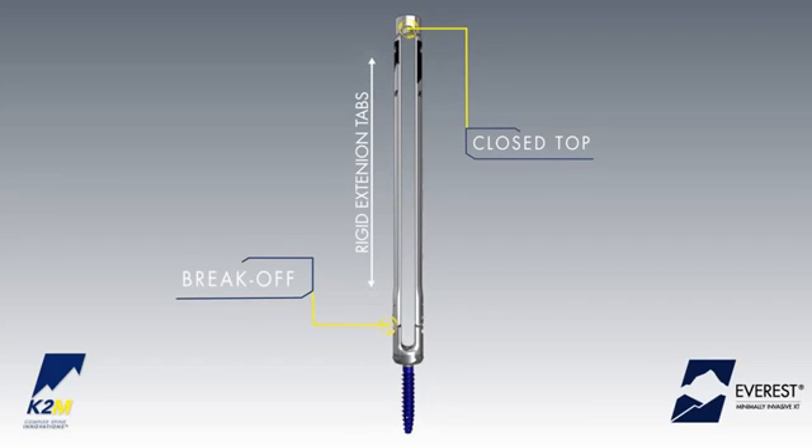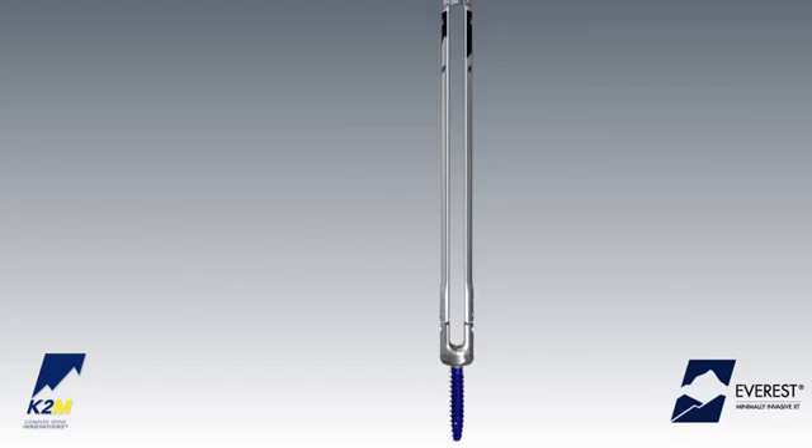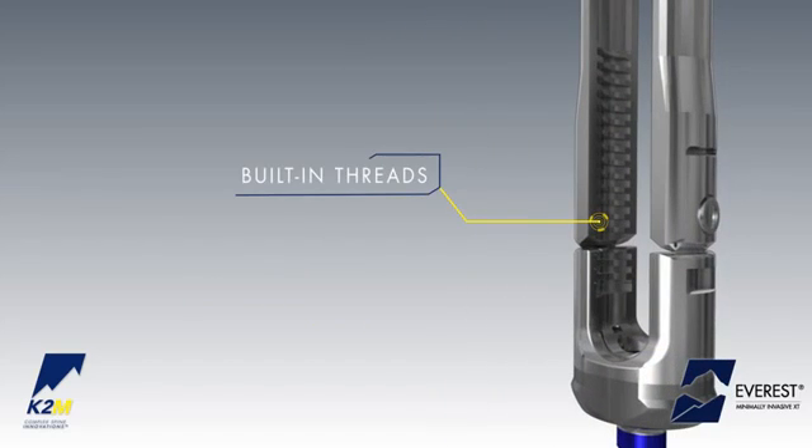The XT screw is designed with rigid, closed-top break-off extension tabs to assist with minimally invasive rod passage. Built-in threads within the extension tabs allow for 25 mm of internal rod reduction.